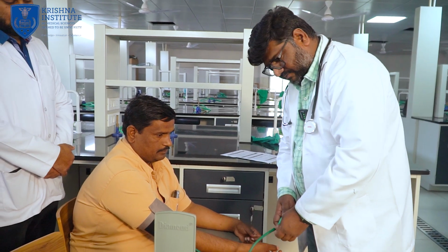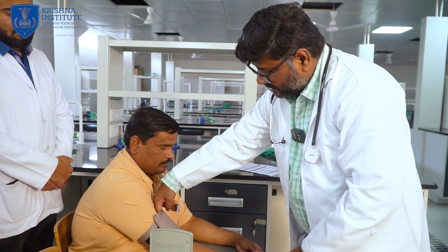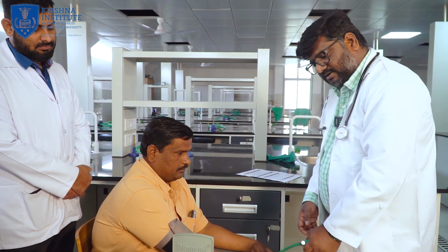slowly inflate the cuff. Sir, I have a question. The cuff that you have put on, how loose should it be? It should be two fingers. It should not be too tight or too loose. Okay, sir. Slowly inflate the cuff.